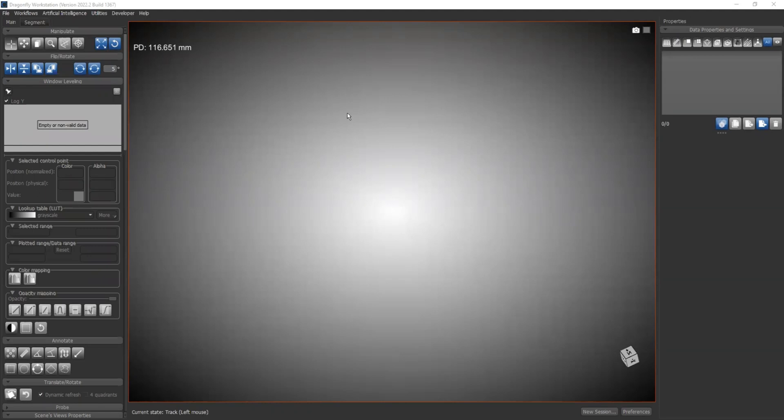Hello everyone. In this video, I'm going to show you how to reconstruct the Cone Beam CT image using the CT reconstruction plugin in Dragonfly, the latest version, version 2022.2.